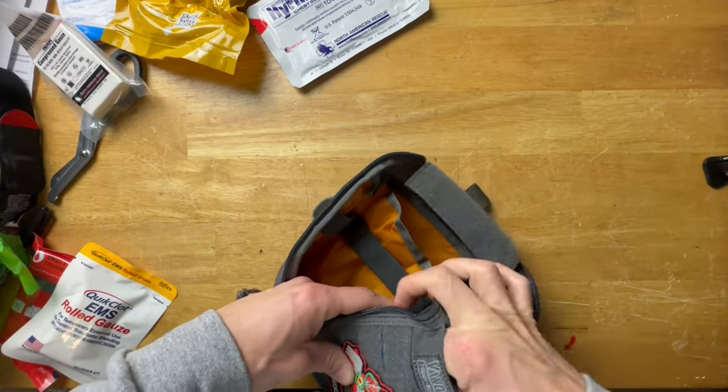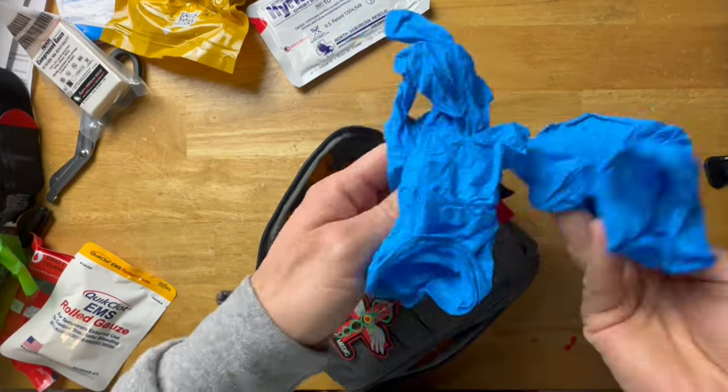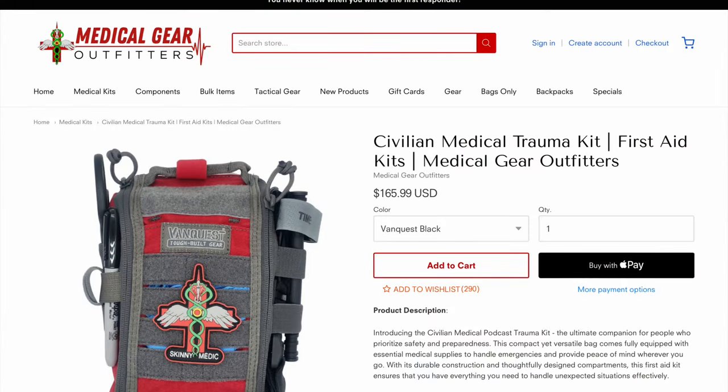There are also two pairs of gloves in the front pocket. If I'm going hands-on with someone I don't know, I'm going to take the couple seconds to put gloves on — people are nasty, you never know. The price for all of this is $165.99 before you use the discount code 'tiberius,' which saves you 10% — roughly $16.50 off. I want to stress again: all the cool gear in the world is pointless without the knowledge to use it, especially in a stressful situation. Get the training.